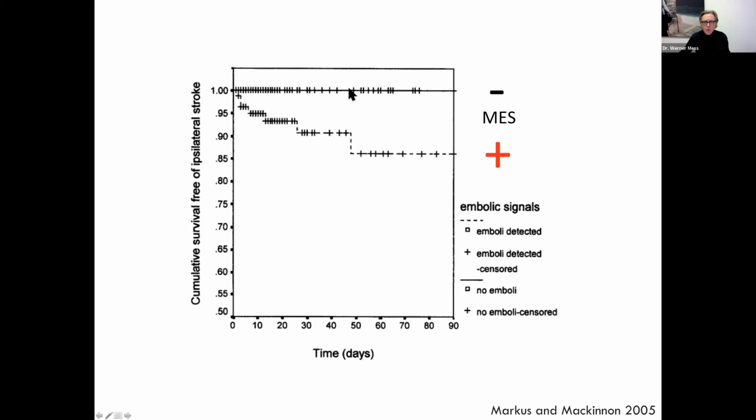Here on top, we have emboli negative patients, here the emboli positive patients. So no new event occurred in the embolus negative group. And of course, new events, approximately 15% in the emboli positive group.